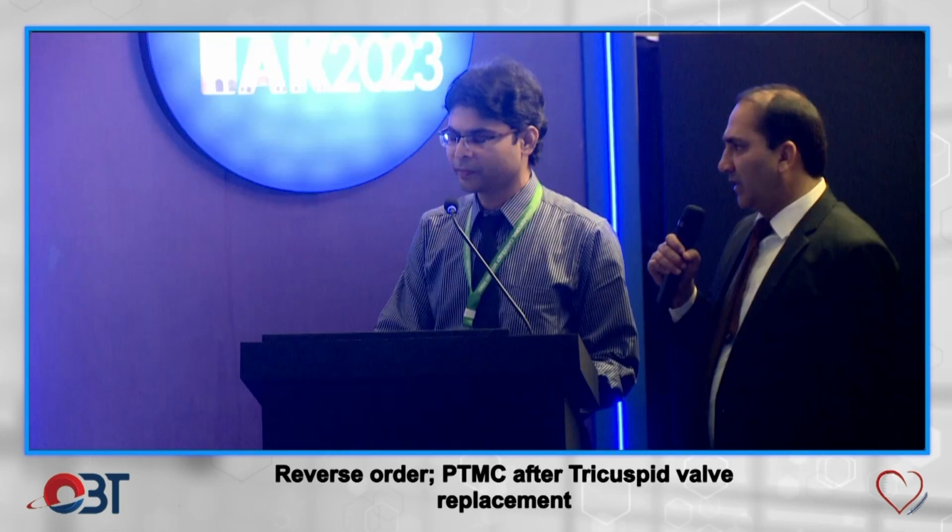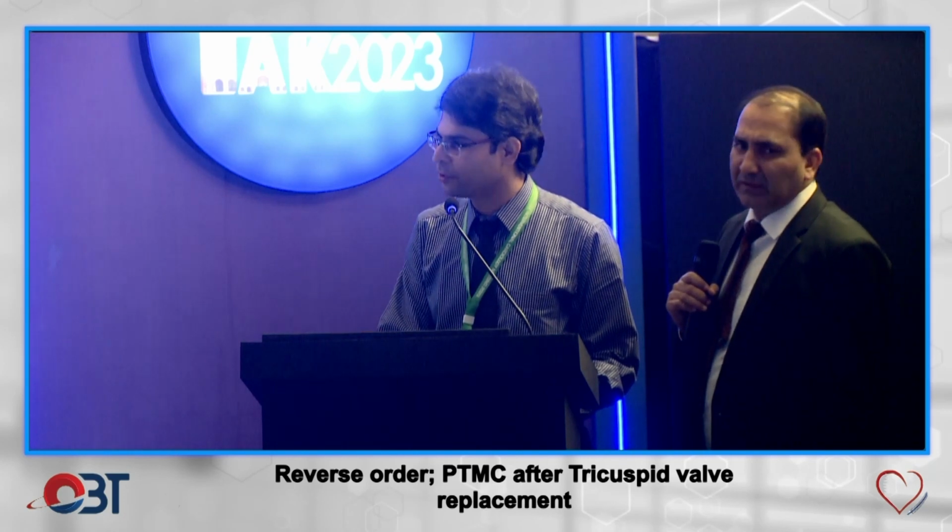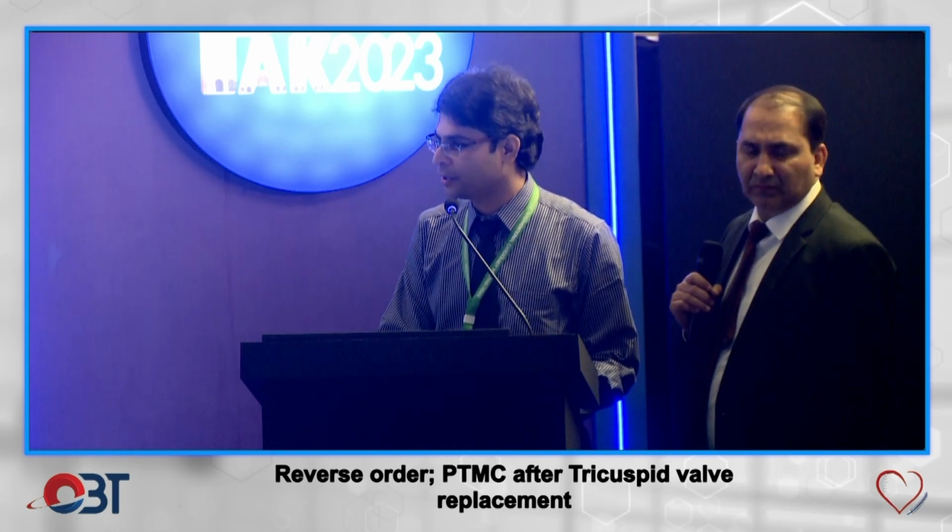नहीं, tricuspid valve तो क्रॉस नहीं करा ना. नहीं नहीं, मैं वही तो कह रहा हूँ ना, we didn't cross the tricuspid valve, because we entered from the IVC into the RA. Yes. And we didn't go into the RV because of the tricuspid valve, so we couldn't take the RV pressure. हम गए नहीं ना, हाँ, वहाँ वो तो अब.